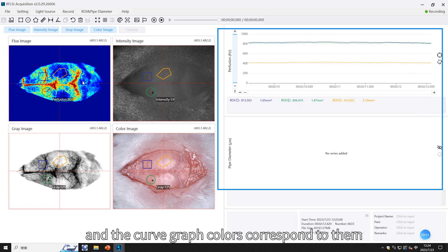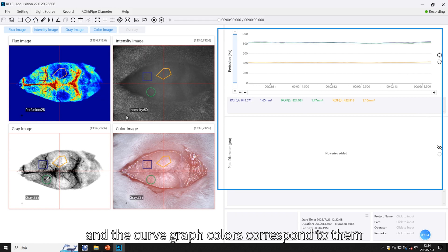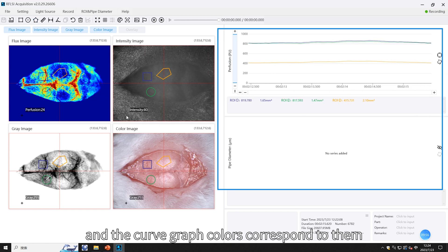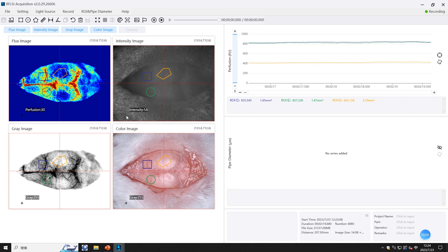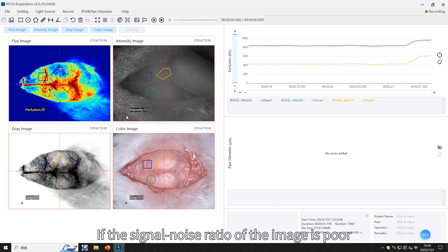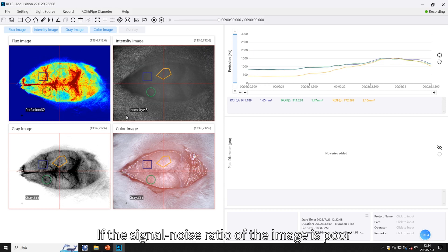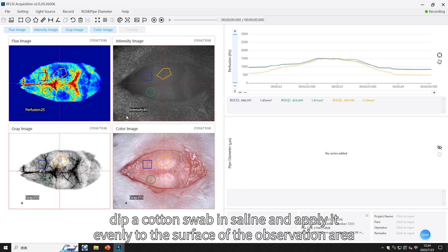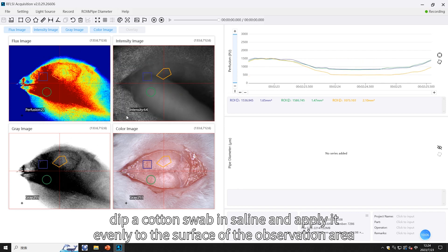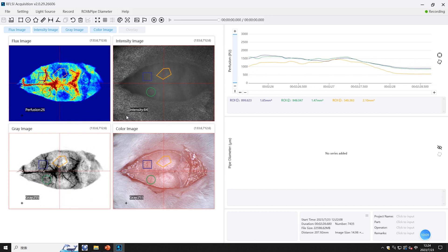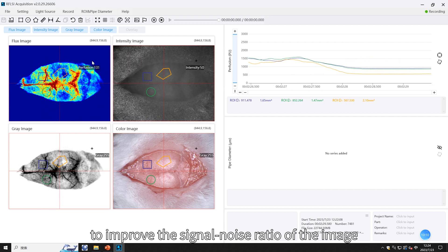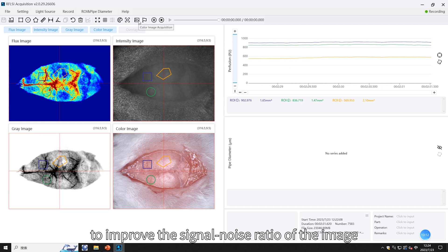Different ROIs and pipe diameters are distinguished by different colors, and the curve graph colors correspond to them. If the signal-to-noise ratio of the image is poor, dip a cotton swab in saline and apply it evenly to the surface of the observation area to improve the signal-to-noise ratio.